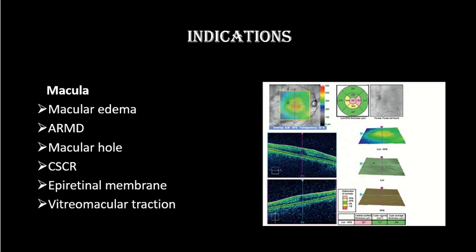The indications for OCT include macular lesions such as macular edema, age-related macular degeneration, macular hole, central serous chorioretinopathy, epiretinal membrane formation, and vitreomacular traction.